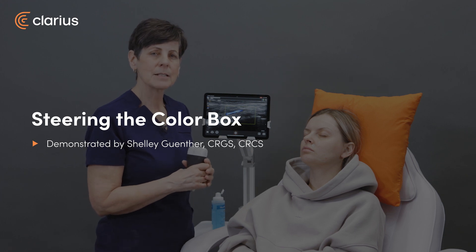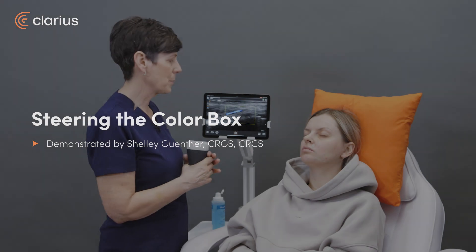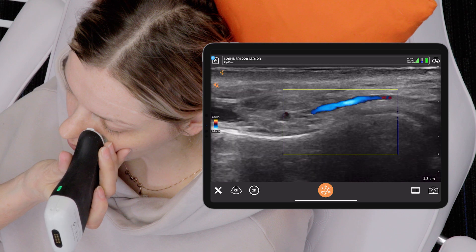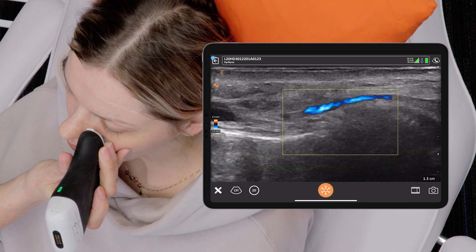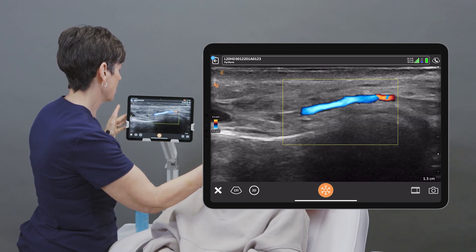Hi, my name is Shelley and today I'm going to talk to you about how to steer the color box on the Clarius app. I'm just going to locate the angular artery here and I'll move my color box up just a little bit so that the vessel is in the center of the color box.